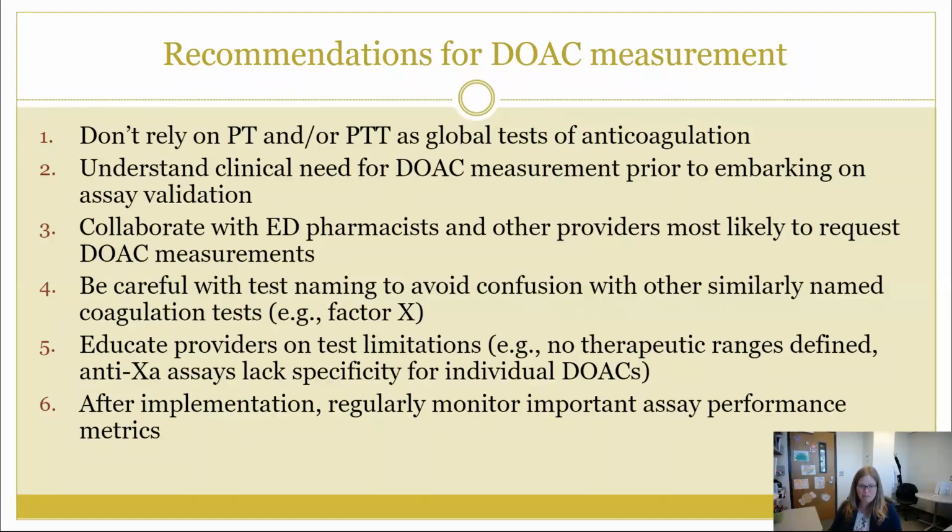It's important to educate our providers on limitations of the tests, meaning it might be difficult to interpret a measurement once we're able to get one for you. And if you have both DOACs and something like heparin present, our assays, the most rapidly and widely available assays, are not going to be able to differentiate those different anticoagulants.